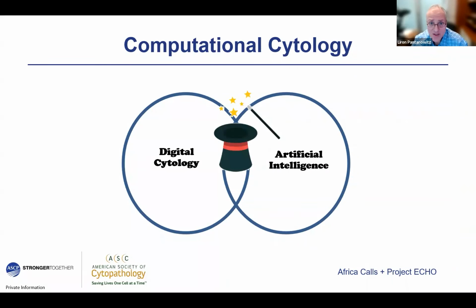Well, we have reached this era of what we call computational cytology, using computers to help practice in the field of pathology, because now we have digital cytology, we can digitize and scan slides. And once we have those digital images with all the pixels containing data, we can apply artificial intelligence. And the field of AI has advanced a lot too. People have gone from simple algorithms to very complicated algorithms, which sort of mimic the human brain artificially.